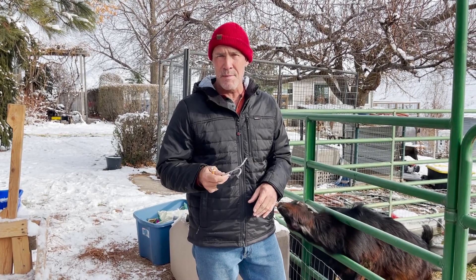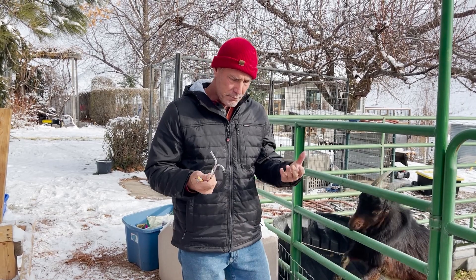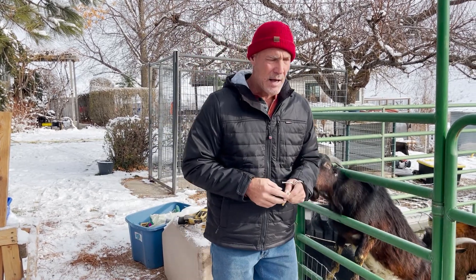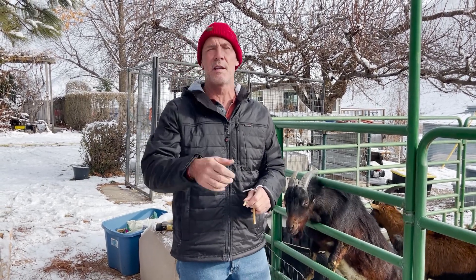We use the California Bander. You can get these on packgoats.com. As a goat club member you get them at 10% off, like you do everything else. There are people online that'll argue vehemently that surgical castration is best, that the Burdizzo is best, and that banding is best.